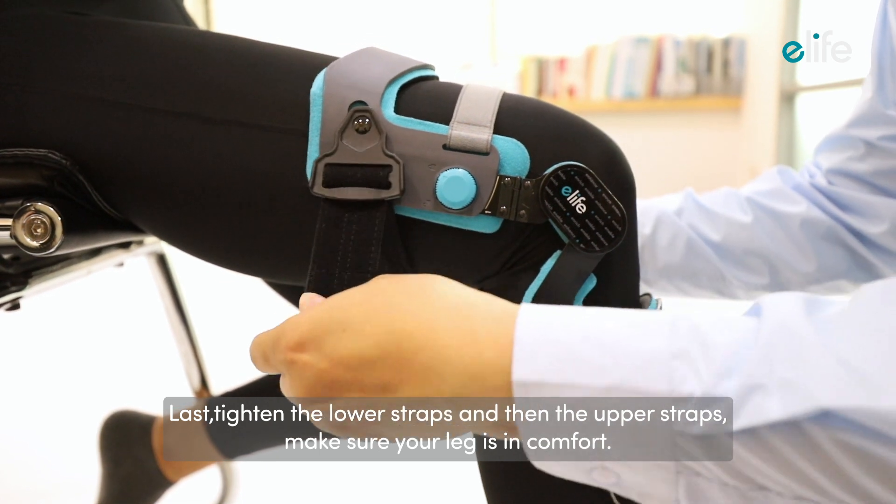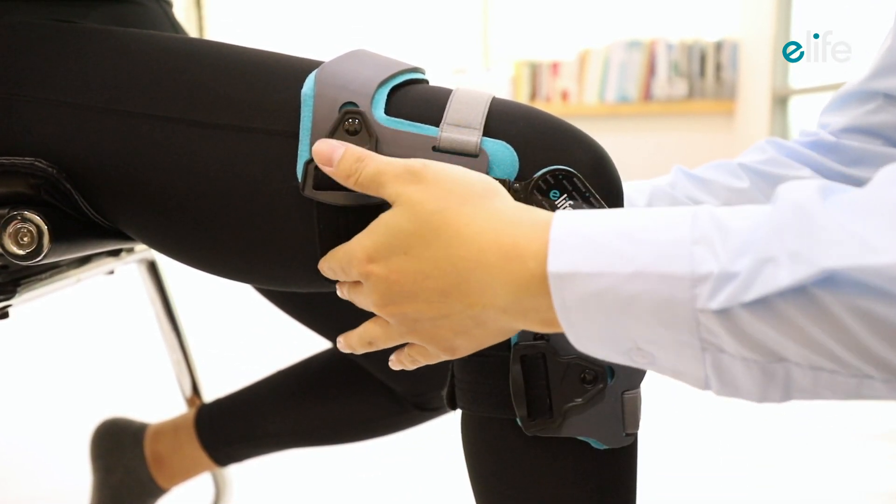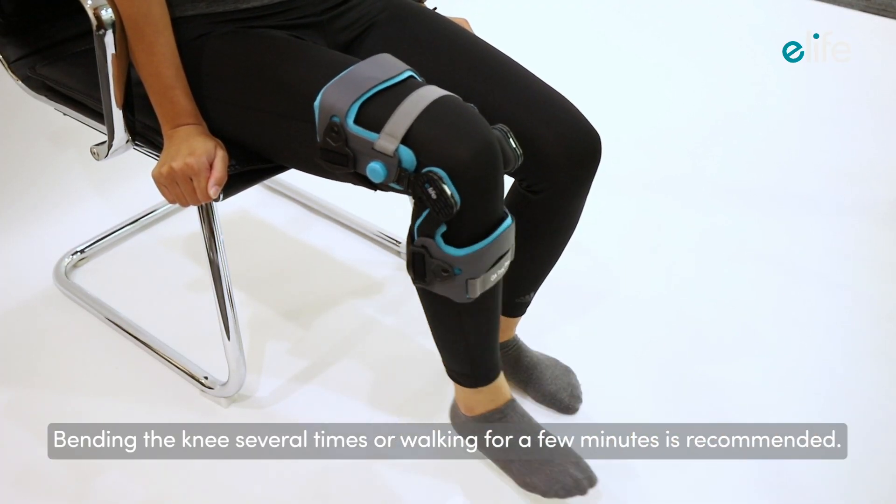Make sure your leg is comfortable. Bending the knee several times or walking for a few minutes is recommended.